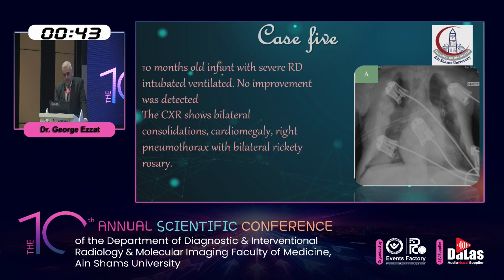In case 5, this is a 10-month-old infant with severe respiratory distress and no improvement after intubation. Chest X-ray shows bilateral consolidations and right-sided pneumothorax. I don't know if you can pick it up from here. There's a right pneumothorax and bilateral rickety rosary.